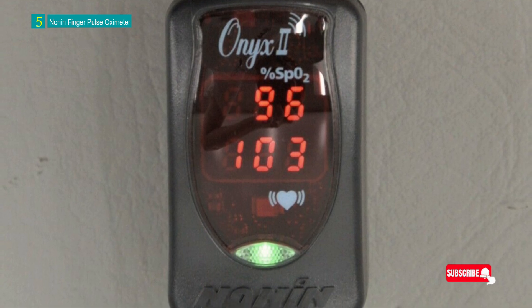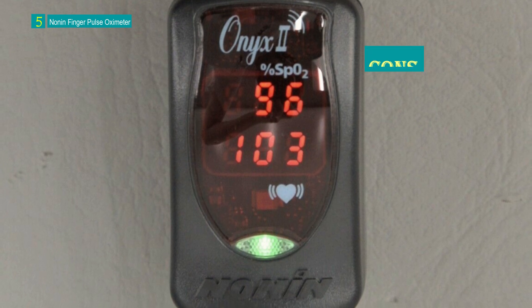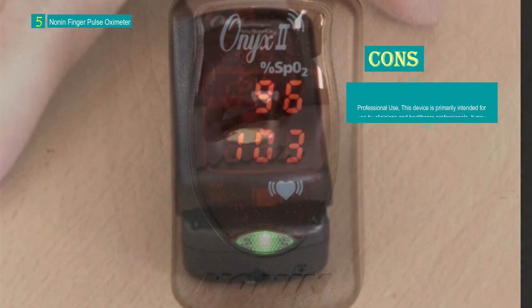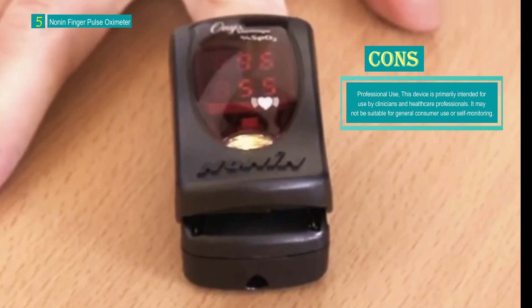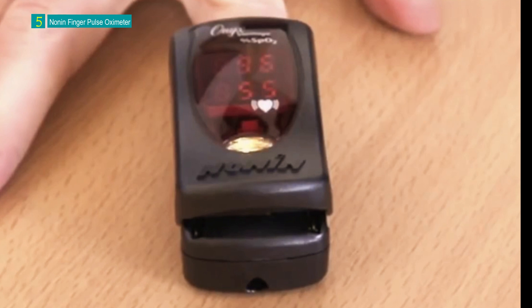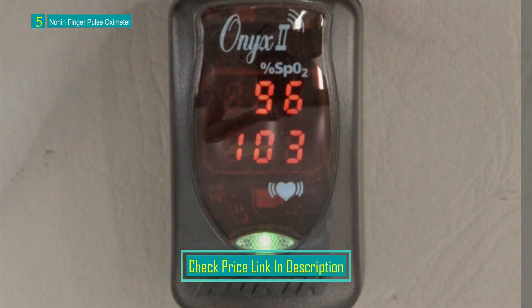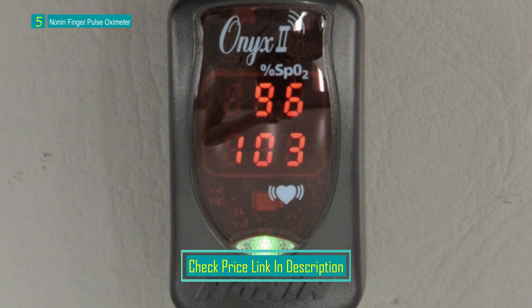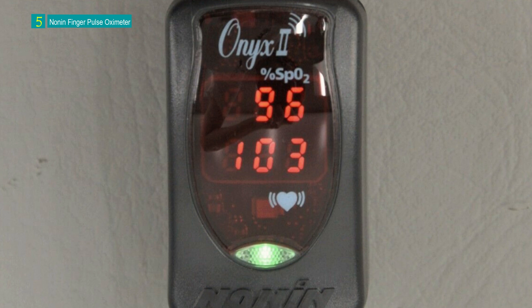This oximeter is suitable for a wide range of patients, accommodating finger, thumb, and toe digit thicknesses ranging from 8mm to 25.4mm. It is equipped with Onyx Purisat SpO2 technology, which is scientifically proven to offer accurate readings even in challenging scenarios such as low perfusion or darker skin tones. Additionally, the device is designed to work effectively even when the patient is in motion.